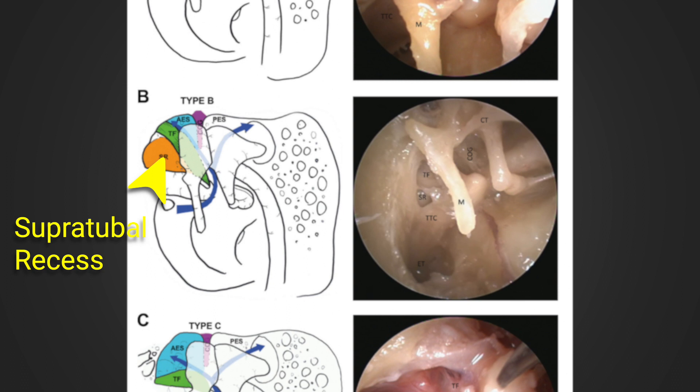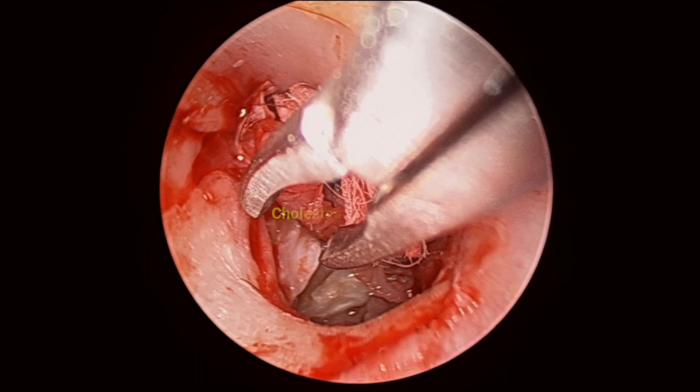Here we're lifting up a tympanomeatal flap — right ear — with the chorda tympani seen here, with disease over the stapes and over the round window.